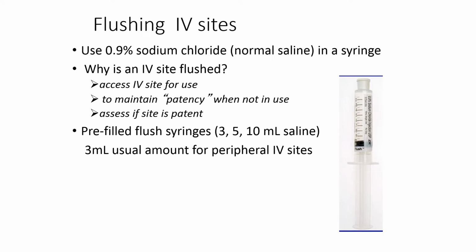So in the clinical setting, when you do your head-to-toe assessment and we notice that a patient has an IV, again, we're going to look to see, are fluids running in that IV? Does the site look okay? And if everything's running okay, we don't necessarily need to flush it. But say that the fluid was running very sluggishly or the pump was going off, we may at that time flush the IV to make sure that it is patent, that there is no problem with that IV. If patients don't have IV fluids going, we would want to flush that IV site at least once a shift or per agency policy.